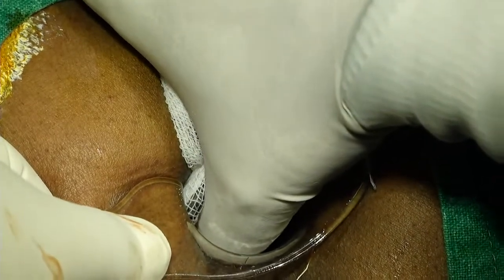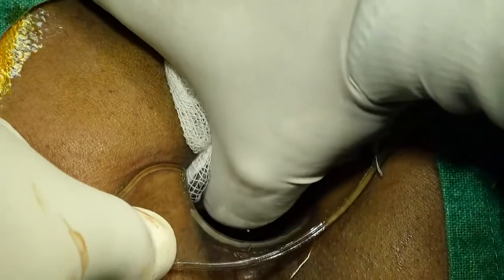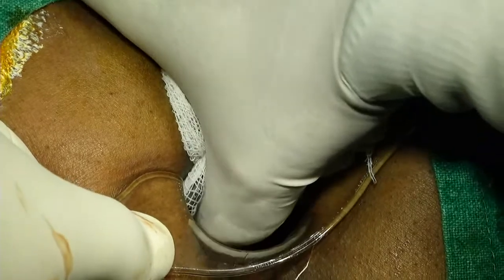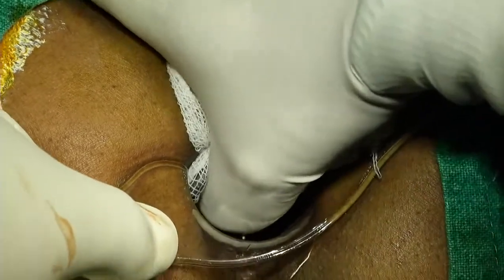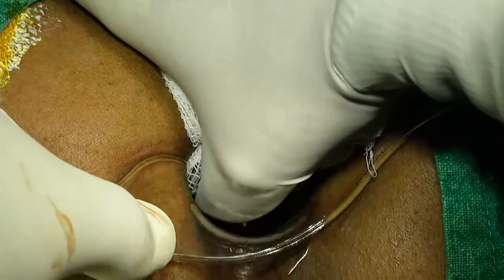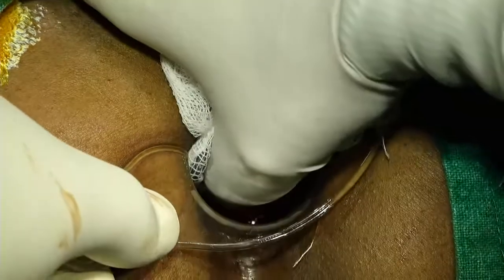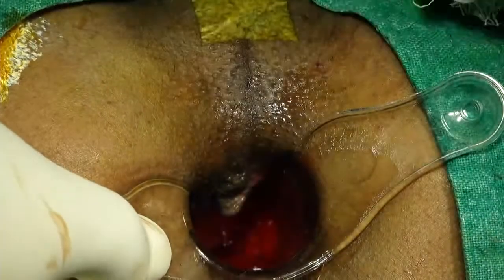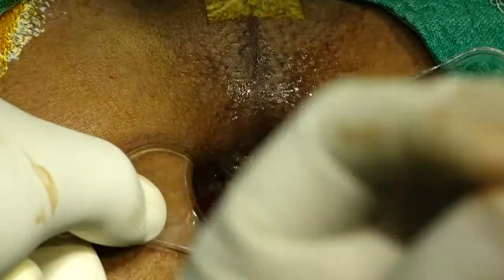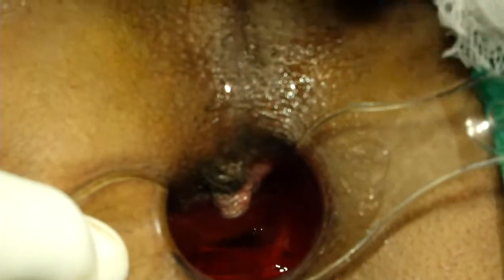We are doing 8 to 10 per month in my medical college because medical college is free for that, there are a lot of patients for hemorrhoids here. Compress for at least 2 minutes so the effect of this thermal energy will be reduced, and because of this ice vasoconstriction the pile mass will be reduced. You can see on the table that 70% of the pile mass will disappear and 30% will disappear within 1 month. This is the beauty of this laser on the table.